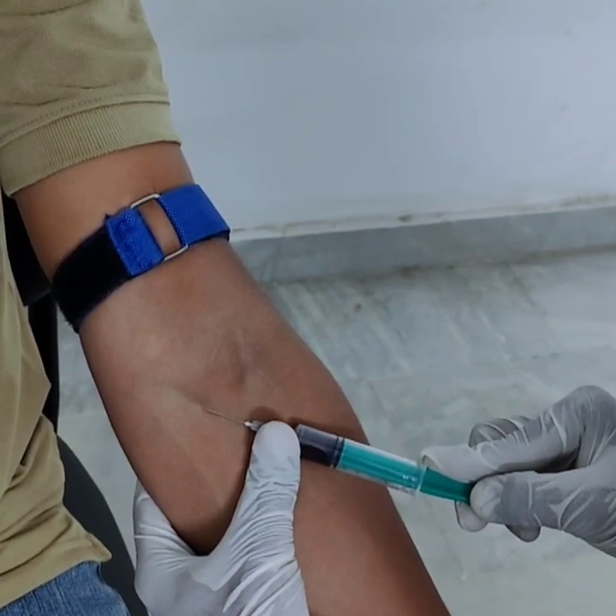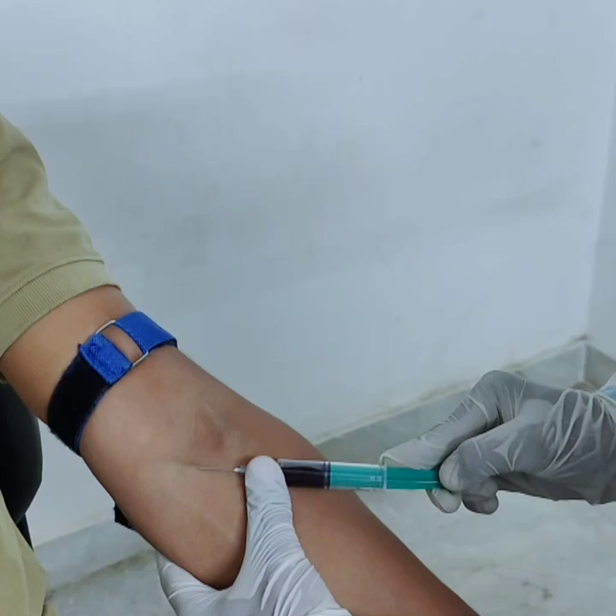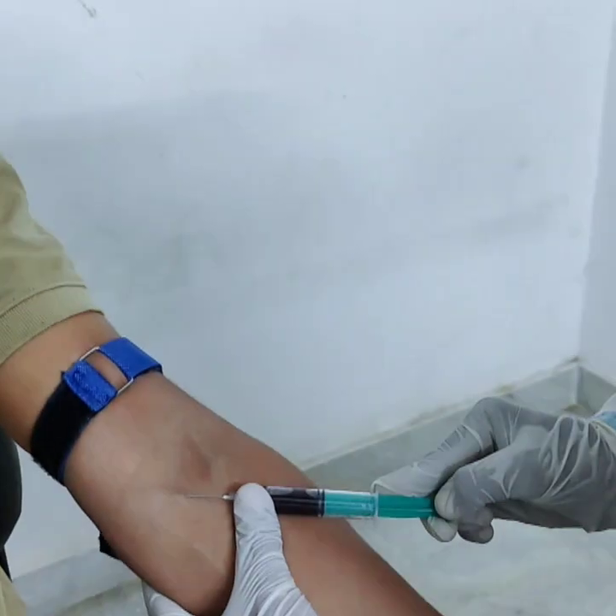Then, fill the tubes in the correct order if multiple tests are ordered. Do not shake the tubes — gently invert them if needed.